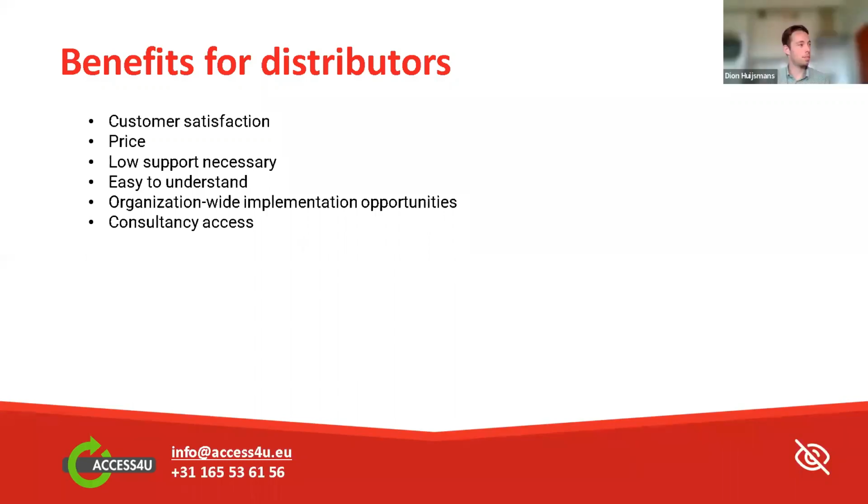Yes, nice. He also asked whether USA is recognized by the medical insurers, whether it has an EU medical aid number. Yes, it is. We also deliver it in the Netherlands to health insurance companies. Yes, exactly. And he also mentioned that up to now he has used Supernova at work, but he just retired, so he no longer has the support of an employer. But what happens to the number block in Supernova? He loses the use of the number block as a number block because the keys are used to control Supernova.